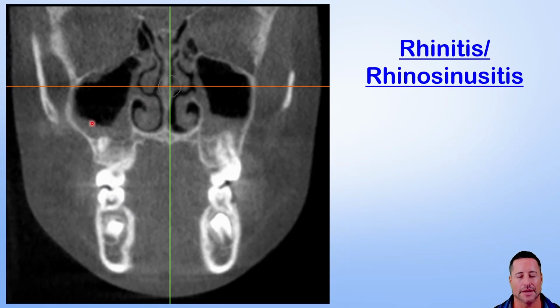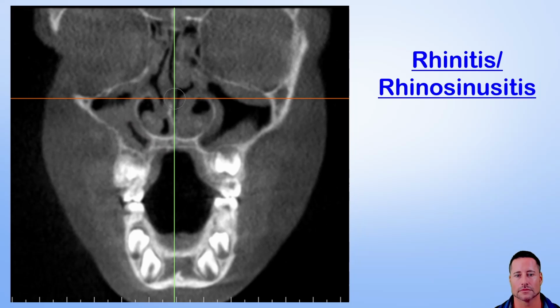Again, mucus lining here, mucus in the maxillary sinuses, ethmoids are filled up, and the inflammation in the nasal passageways. Same, again, see all this. And when you see this, again, this is a young kid. Look at the palate. Look at that high vaulted palate, insufficient space for the tongue. It all makes sense. And again, keep these images in mind as we go through future podcasts.